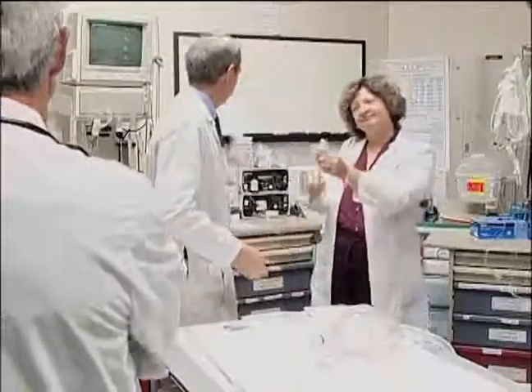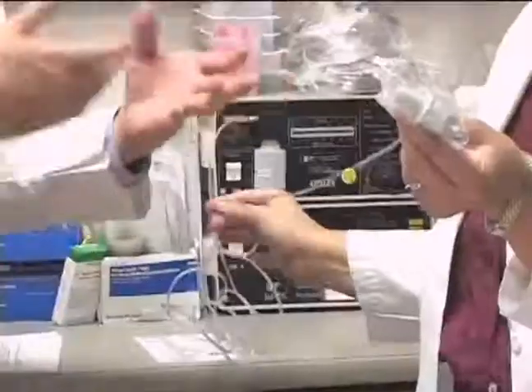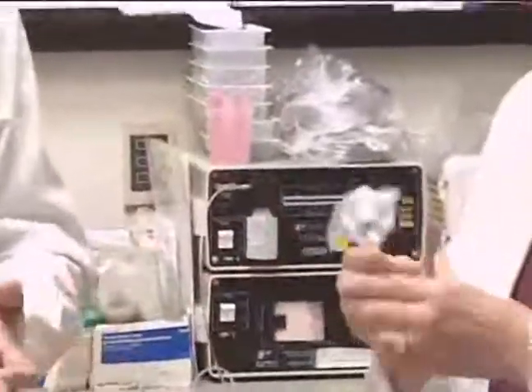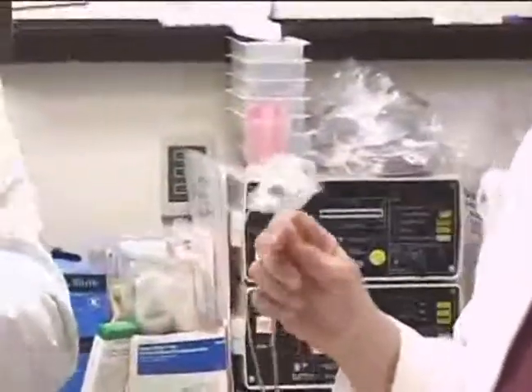Also, we have the capnograph to put on the patient. We have both a visual capnograph that will give a digital readout on their PCO2, and we have the small capnograph that changes from yellow to purple, yellow to purple.